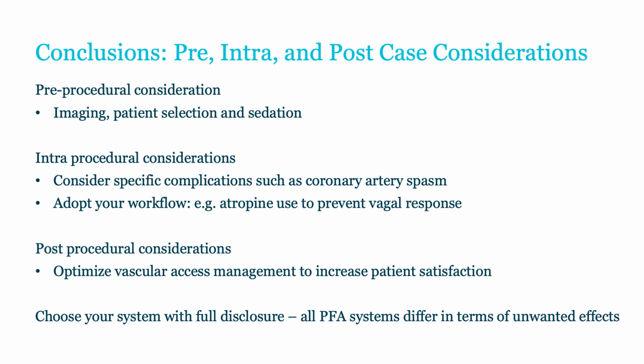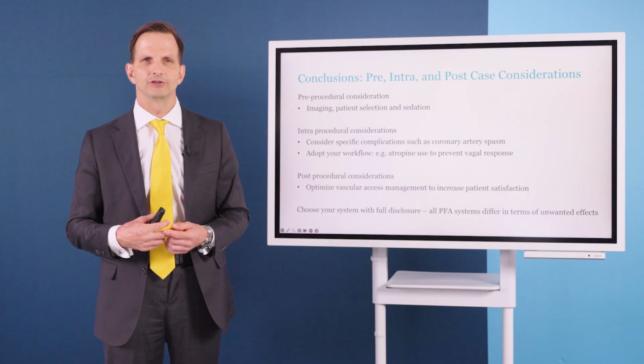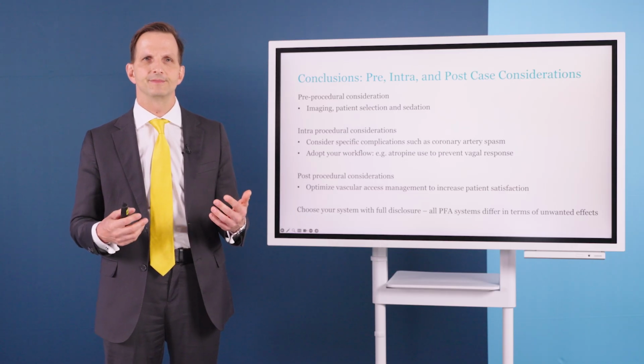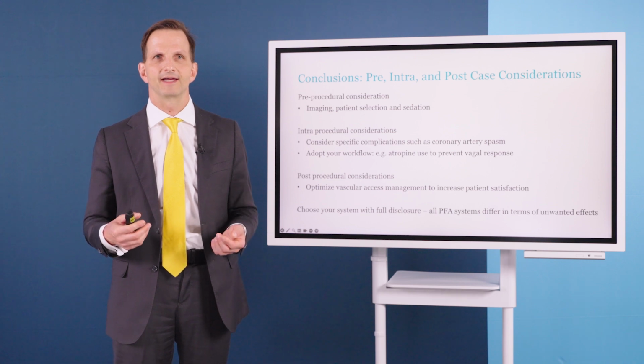After the procedure, you have to optimize your vascular access management in order to increase patient satisfaction and reduce the most common complications, which are vascular access complications. Most of all, choose your system with full disclosure. All PFA systems differ in terms of unwanted effects.